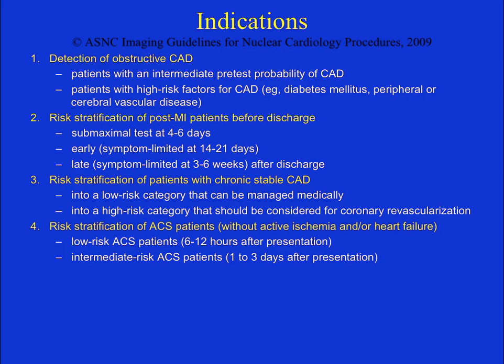So what do we do? When the patient is having chest pain, we inject a tracer, and after the symptoms are controlled, we do the imaging with a gamma camera, say around 4 to 5 hours later, and that will result in myocardial perfusion imaging images, and those images form the baseline scan, and from the baseline scan we can diagnose whether the patient's chest pain was actually due to coronary artery disease or not.